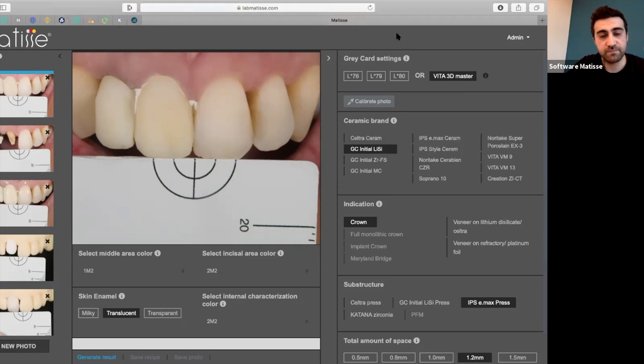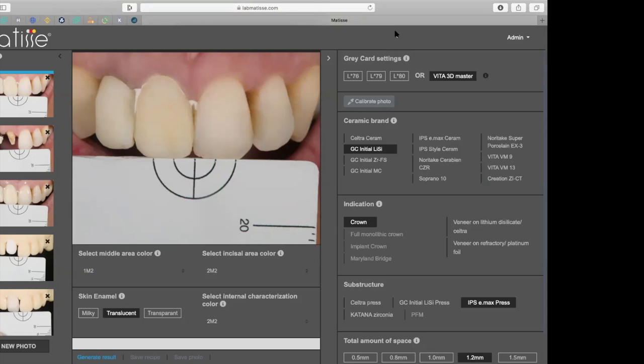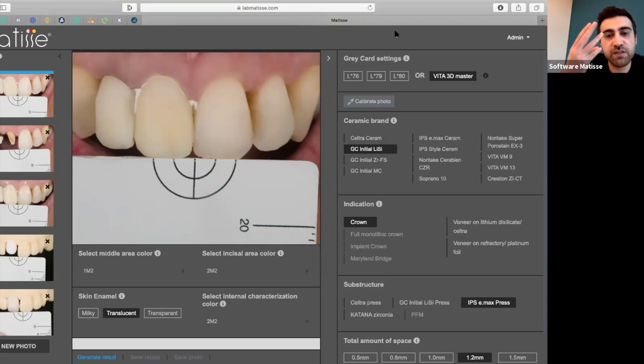How should the photo be taken? How do you take a picture? What kind of picture do you need? You only need the Vita 3D Master shade tabs with the teeth, the scale sample next to the corresponding tooth. You can have three Vita 3D Master shade tabs in the picture, so that you can choose the closest match.